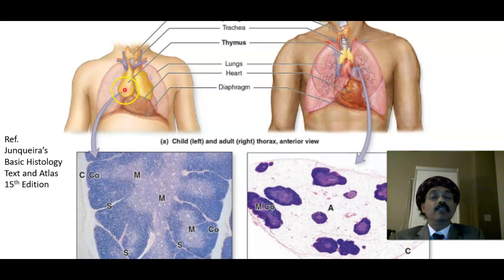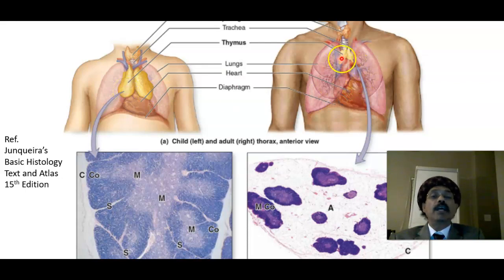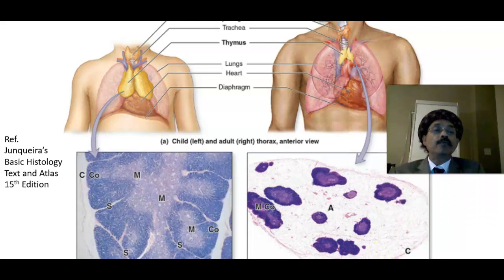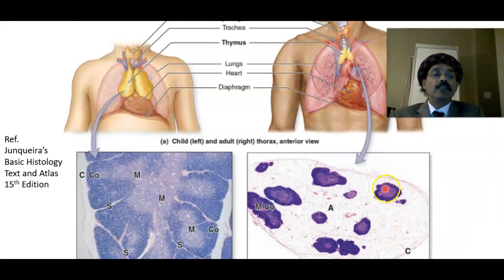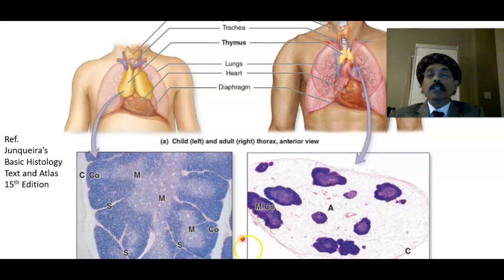The thymus is large in children and atrophied and small in an adult, replaced by adipose tissue. The white area visible here is adipose tissue, and this is the lymphoid tissue with the cortex and the medulla. The medulla contains Hassall's corpuscles, also called thymic corpuscles. This shows the cortex and medulla in a child.